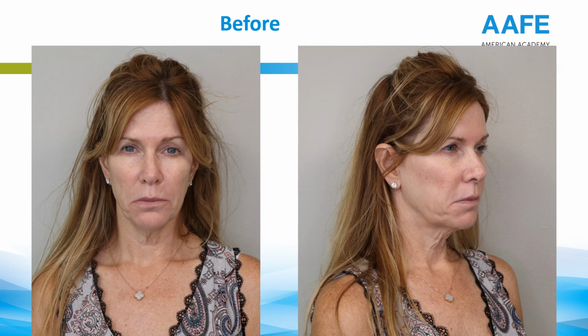Now, she'll get some botulinum toxin. She'll get some dermal fillers. Neither one is going to help with lifting sagging skin. So let me show you a part of her case, and I'm also going to show you some of her smooth thread case as well. So it's everything together as we go through this.